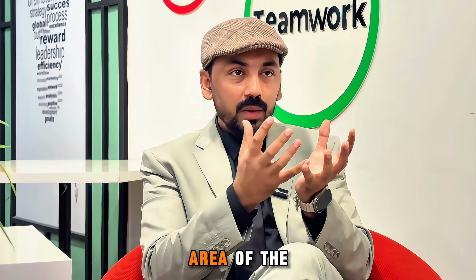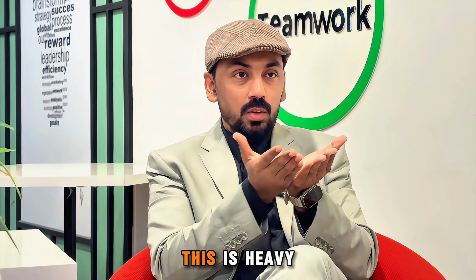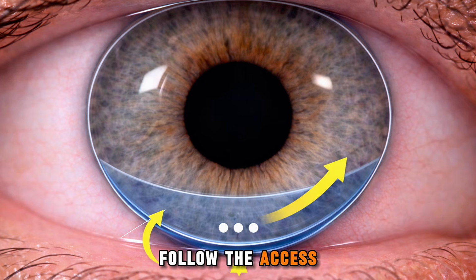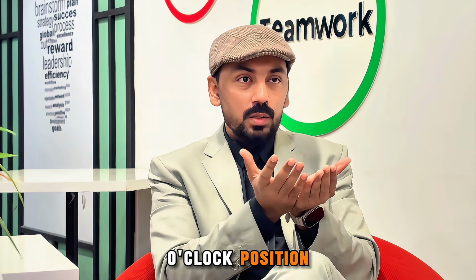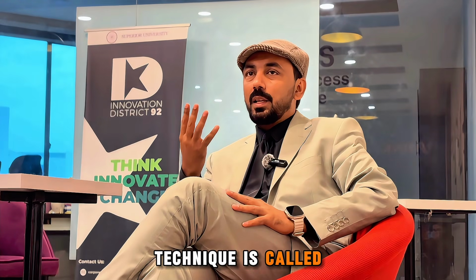So that inferior area of the contact lens, the part at the 6 o'clock position, is heavy. So gravity will apply, and the contact lens will get centered at the 6 o'clock position, right? And that contact lens will follow the axis. So this is how the prism ballast technique applies. The heavy area will come down at the 6 o'clock position, and when the heavy area or the inferior part of the lens comes down, the lens will follow the axis. And the second technique is called the peri-ballast.